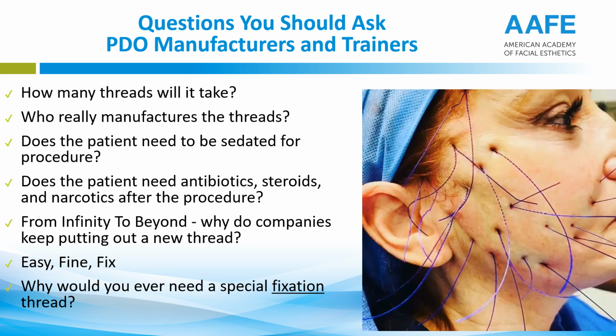They automatically put them on antibiotics, steroids, and narcotics after the procedure. Some of you know this because you've been trained and you've tried some of these cases, and the effect is good, but is it worth the procedure? Why not fewer threads, better technique, and you'll get a much better result. And the other thing, and again, it's not me, these companies do this all the time. Every year, they've got to sell more threads, and they keep putting out new threads.